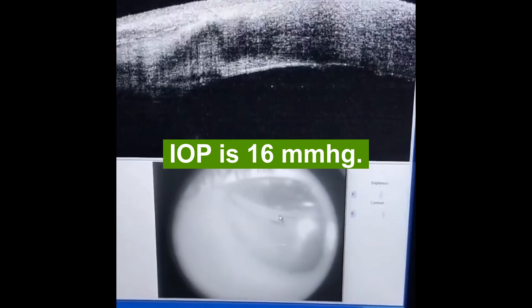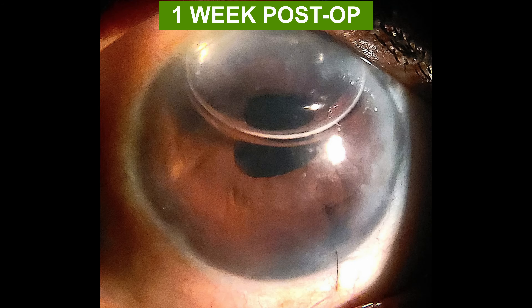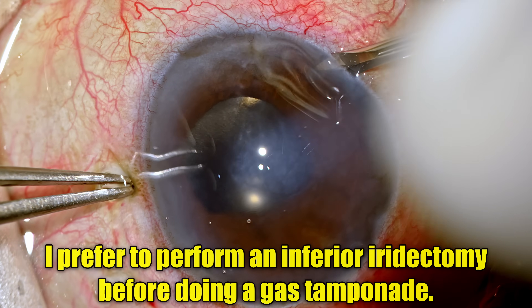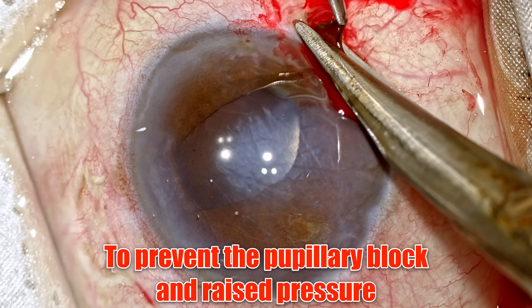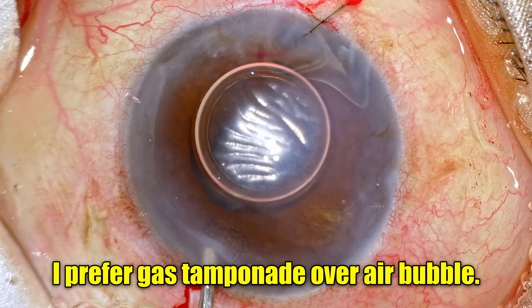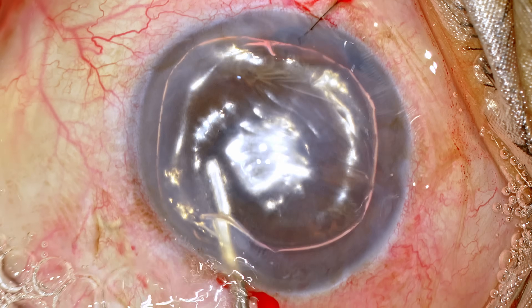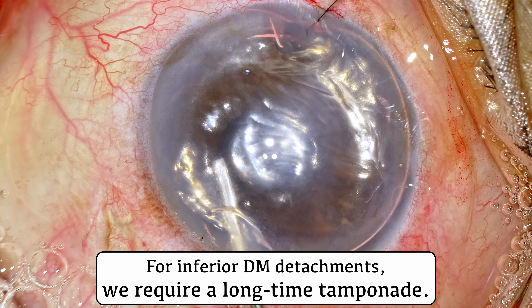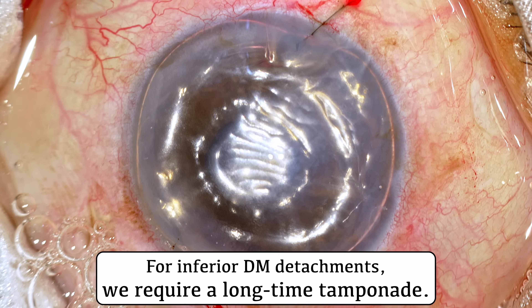These are the subsequent follow-up pictures, and over a period of time the Descemet's membrane has completely attached and the gas bubble has begun to shrink. Key points: when using gas as a tamponade, I would always prefer to do an inferior iridectomy to prevent pupillary block or raised pressure. In cases of inferior Descemet's detachment, I prefer gas over an air bubble. If it were a superior Descemet's membrane detachment, air alone would suffice. The third reason for gas here is that this is a long-standing detachment of more than 4 weeks, which may require a longer tamponade effect.